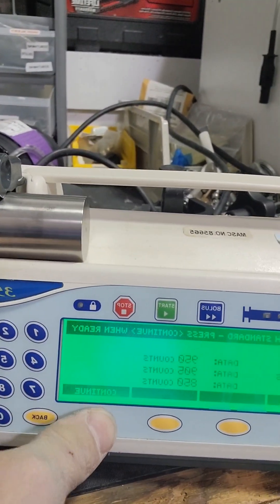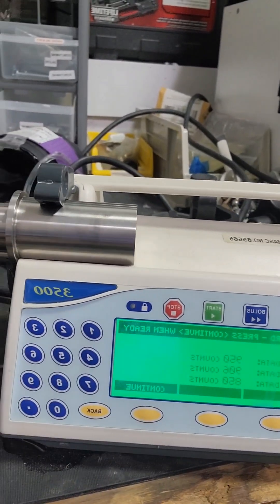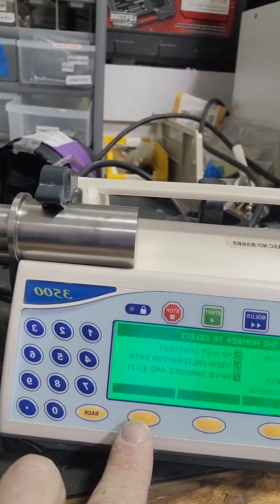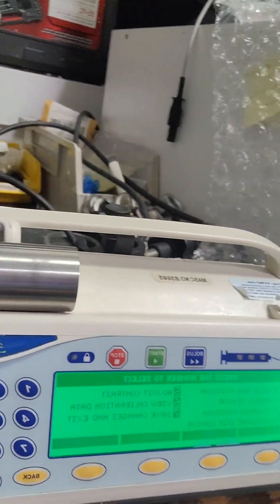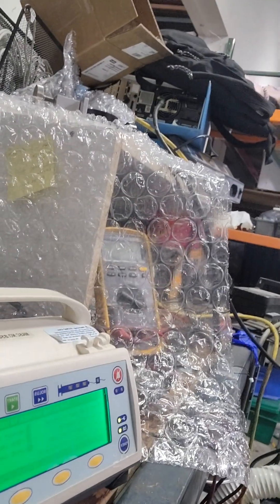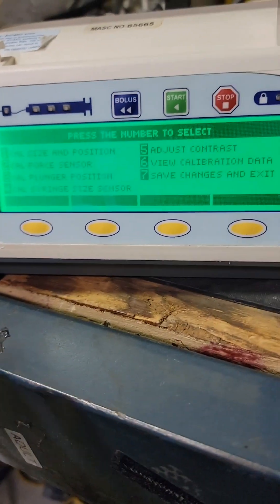There we go, that is cal size and position. Next will be cal force sensor, calibrate the force sensor.